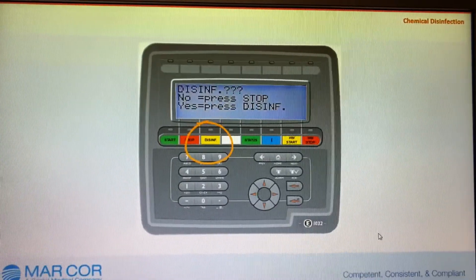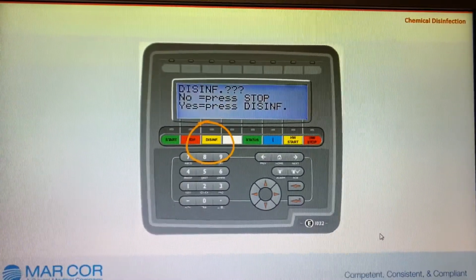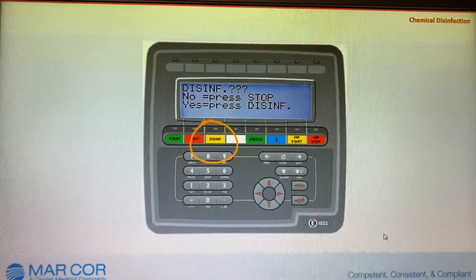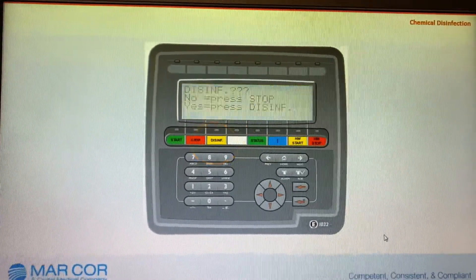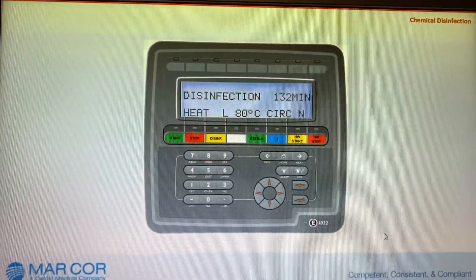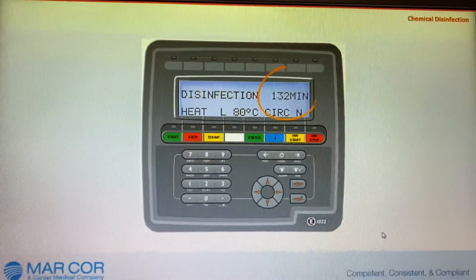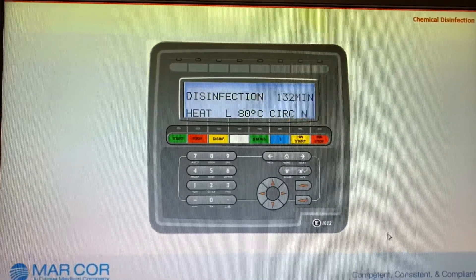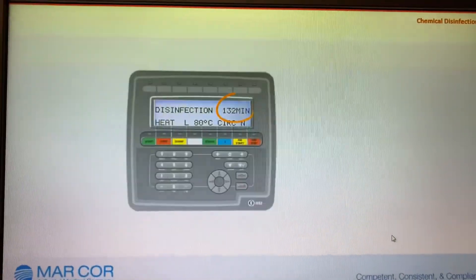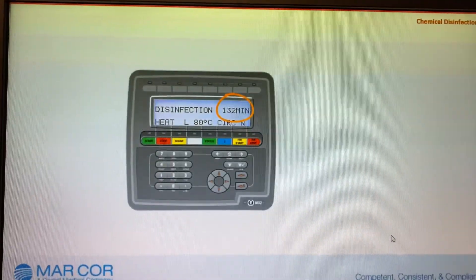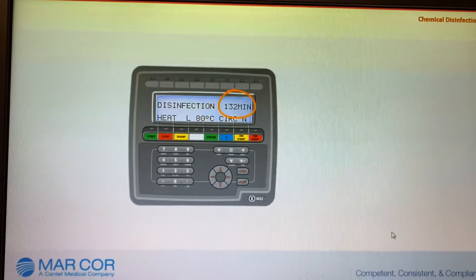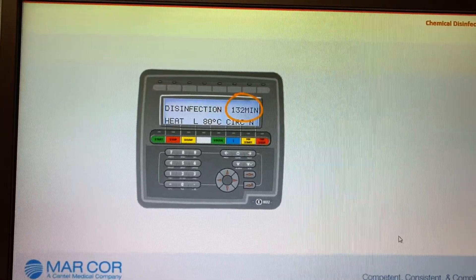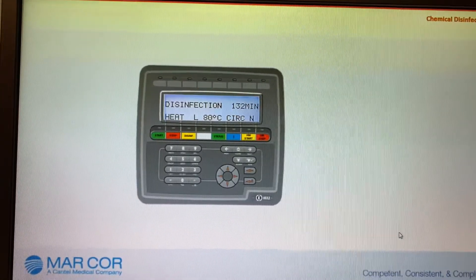Press disinfect for a third and final time. The CWP will automatically perform a disinfection program, which will last for 132 minutes. The remaining time is displayed continuously on the operator's panel.